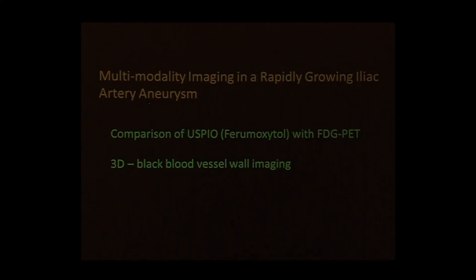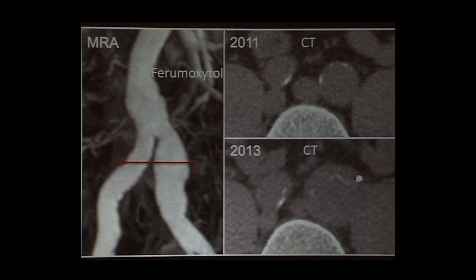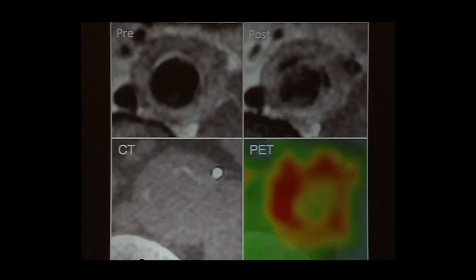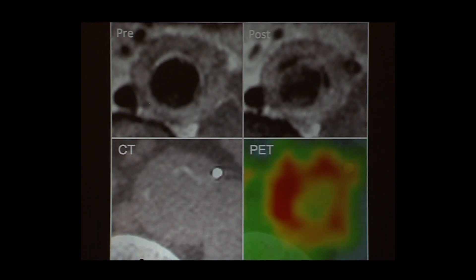In a patient with a very rapidly growing iliac artery aneurysm, we administered ferumoxytol and also performed FDG PET. The CT angiogram showed substantial aneurysmal wall growth over two years. Pre- and post-ferumoxytol imaging clearly indicated a region of inflammatory cell activity scavenging macrophages, and the PET scan confirmed that region was strongly metabolically active — a very good correlation between the two modalities.